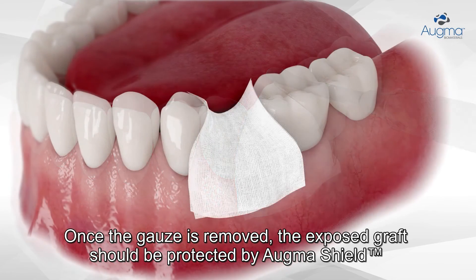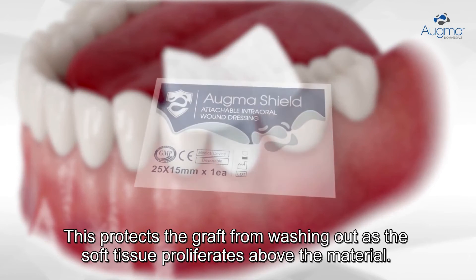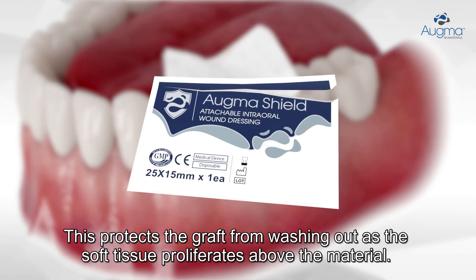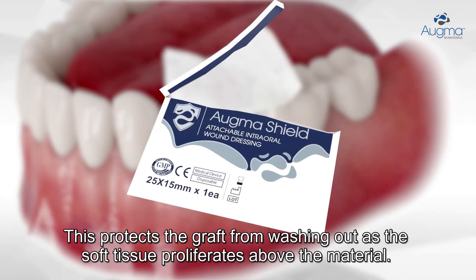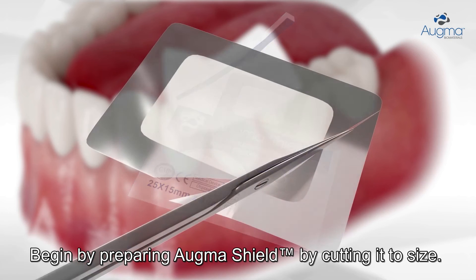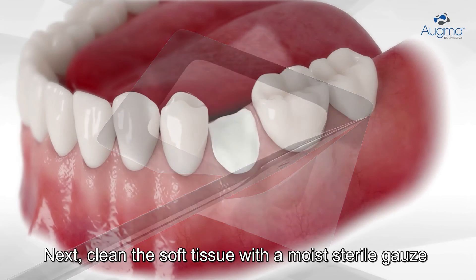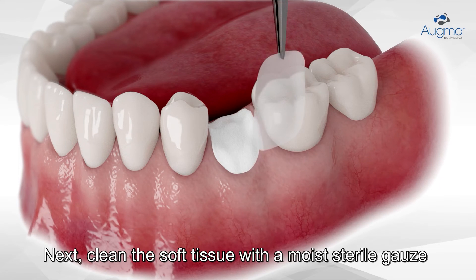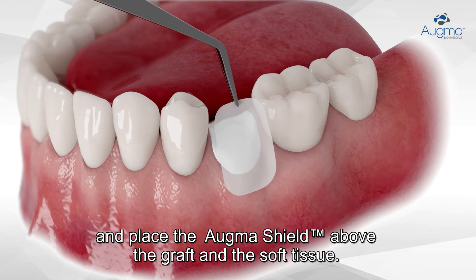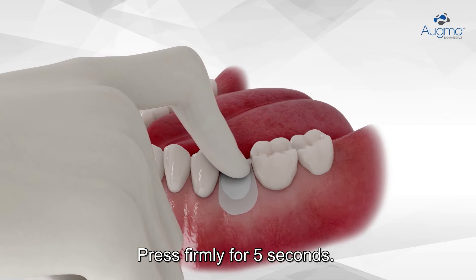Once the gauze is removed, the exposed graft should be protected by Ogma Shield. This protects the graft from washing out as the soft tissue proliferates above the material. Begin by preparing Ogma Shield by cutting it to size. Next, clean the soft tissue with a moist sterile gauze and place the Ogma Shield above the graft and the soft tissue. Press firmly for five seconds.